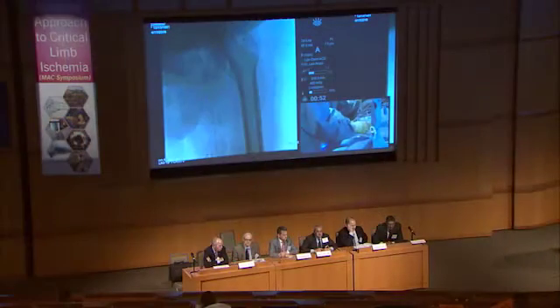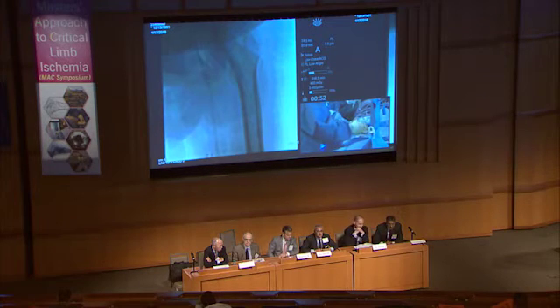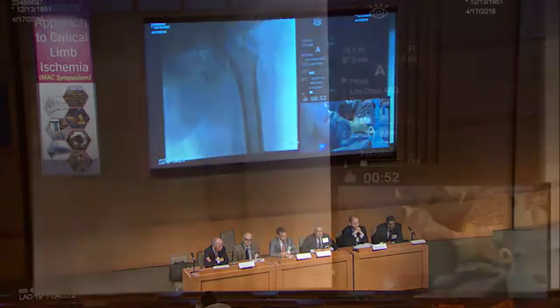So what do you have right now? You have a balloon, you're wiring the profunda right now? I took the wire out, unfortunately, because I thought we were done with it, so we rewired it again now. Okay. I'm just in a branch. Can you give me a torch?